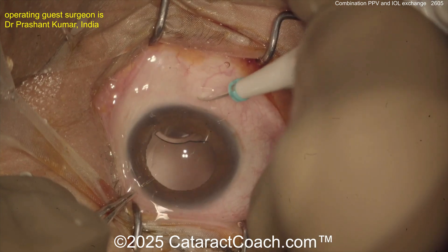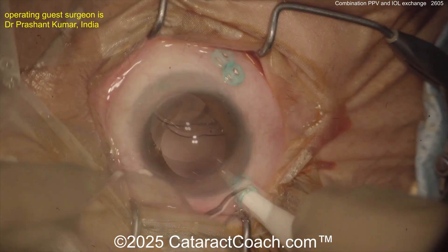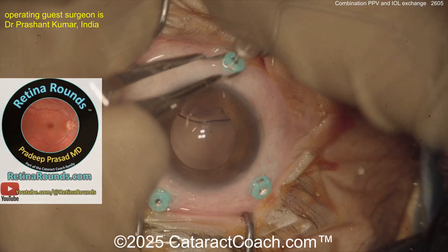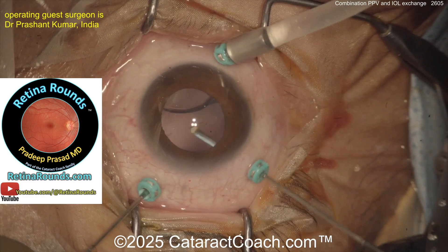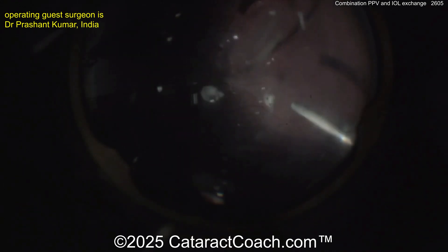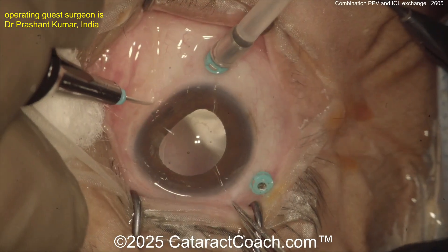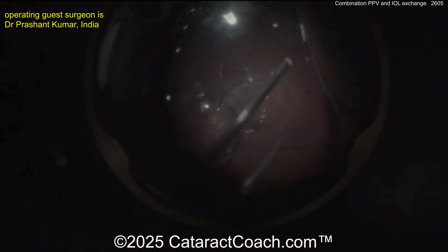We're putting the trocar — explain the trocar placement here. Doing a full pars plana vitrectomy is a really good idea to get all that vitreous out of the eye, prevent any entanglement of the vitreous with the lens, and help decrease the risk for retinal tear and retinal detachment. When the trocars are placed, it's important to place them in a beveled fashion so this will be a self-sealing incision. Here we've got some Triamcinolone — we're going to do a complete vitrectomy, particularly shaving towards the anterior vitreous base, especially where the secondary lens is going to be fixated. You want to get all the vitreous out of that area to decrease the risk for vitreous base traction.